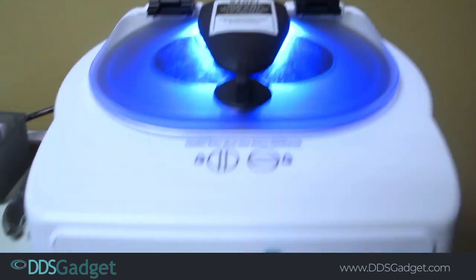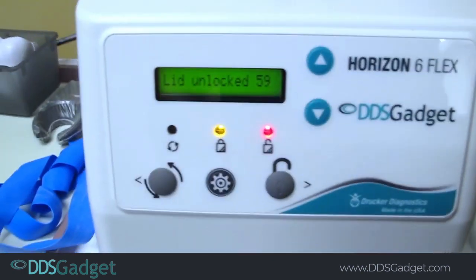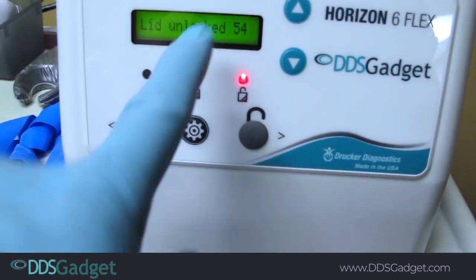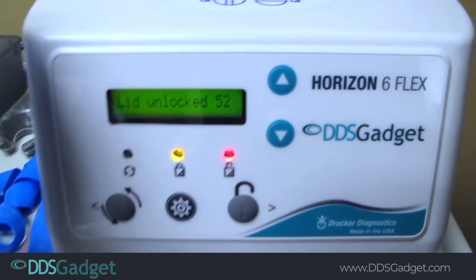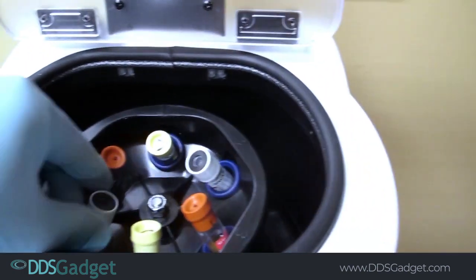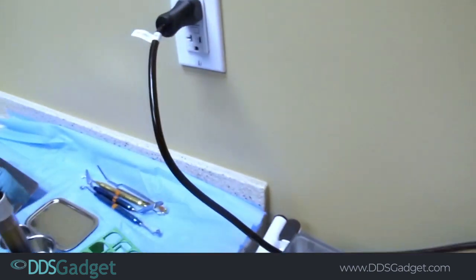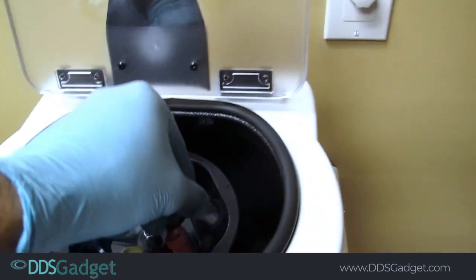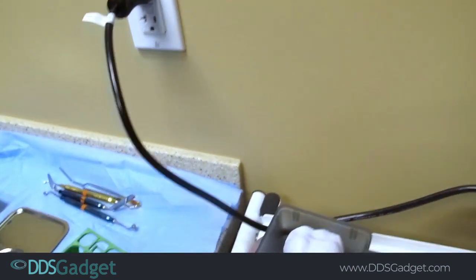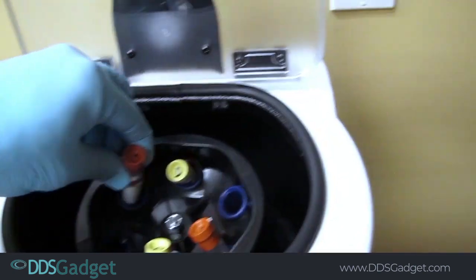It's just about stopping — there's the beep, it's blinking, telling us the IPRF is done. You have about a minute to take this out, after that it locks. So we're going to take the IPRF out. Here's the IPRF — you can see how beautifully that's separated. And here's another one — you can see the nice separation.